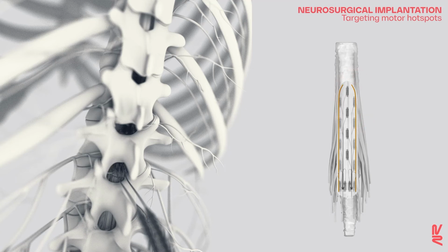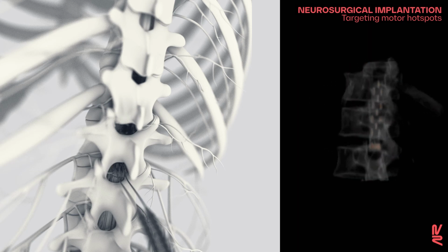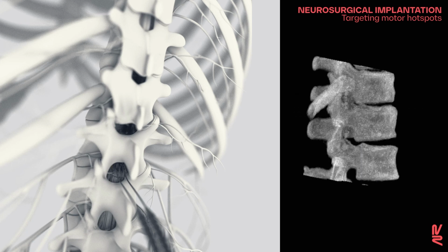Intraoperative testing allows us to refine the position of the paddle lead based on muscle responses to single pulses of stimulation. A 3D CT scan enables the registration of the paddle lead in the computational model to facilitate the configuration of stimulation protocols post-operatively.